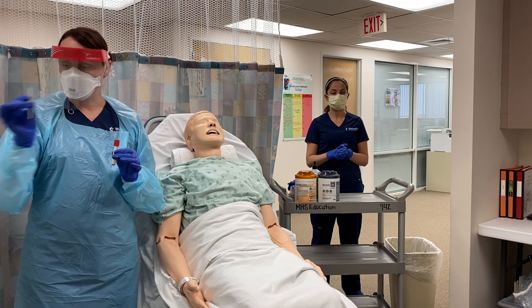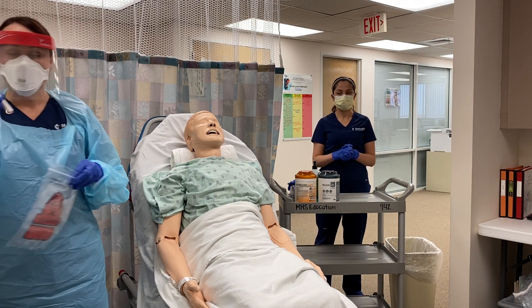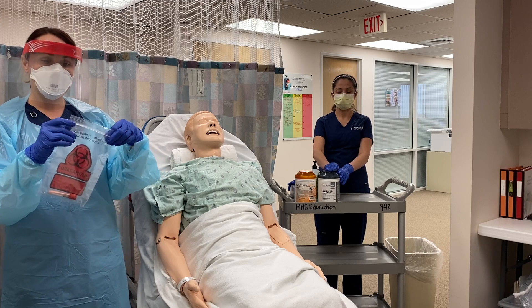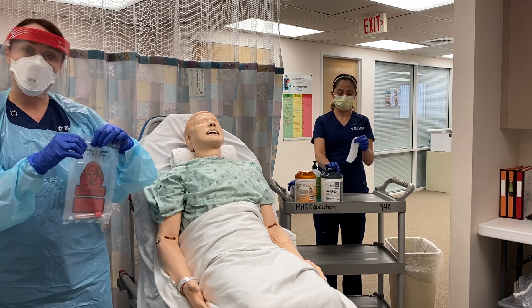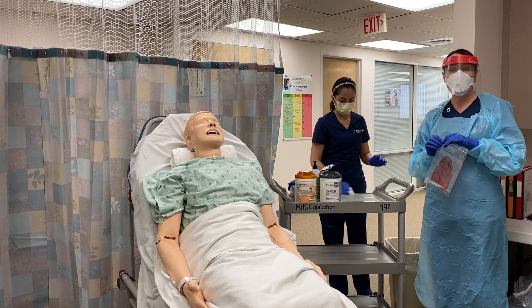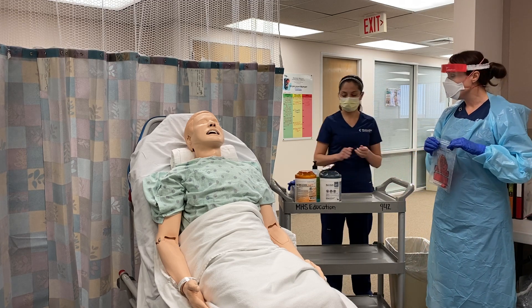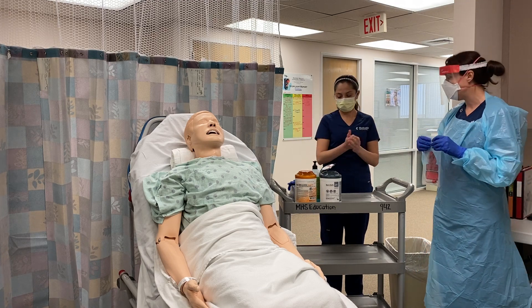You can throw the swab handle in the sharps container when you're done. Now I'm going to take my vial and place it in a biohazard bag, then take it over to my buddy so she can continue to package it up to send it down to the lab. My buddy is preparing the counter surface by wiping it off with a disinfectant cloth wipe — you may use either the bleach wipes or the gray top wipes; either one is just as effective.